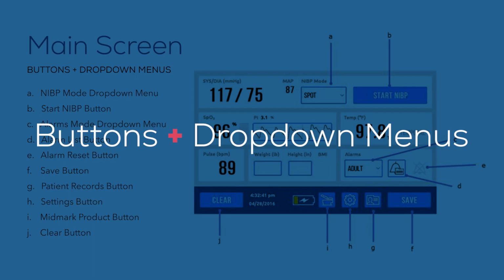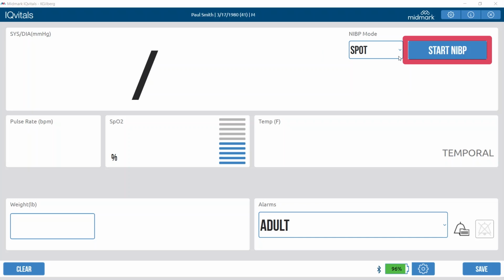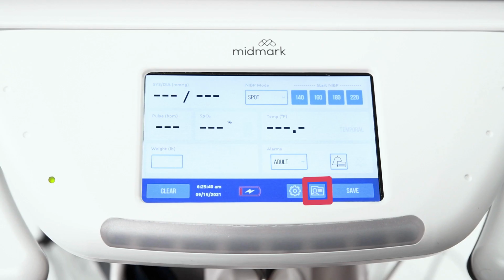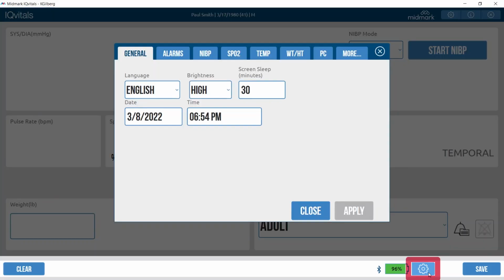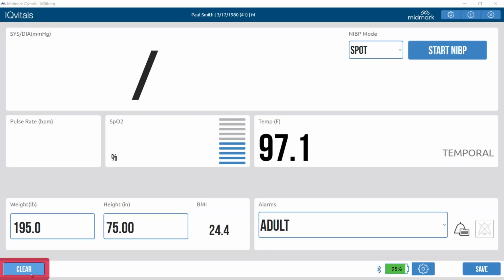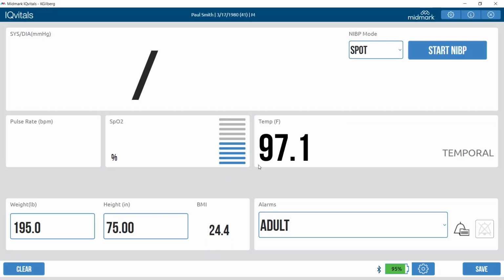Buttons and drop-down menus. The following buttons and drop-down menus are displayed on the main screen. The Start NIBP button, which stands for Start Non-Invasive Blood Pressure, becomes available when the NIBP method is set to linear deflation. Once selected, the Start NIBP button initiates a blood pressure reading. The Patient Records button displays the patient records screen. The Settings button displays the settings screen. The Save button saves the current data to the patient chart. The Clear button will clear weight and height data entered, and any other data displayed on the main screen.